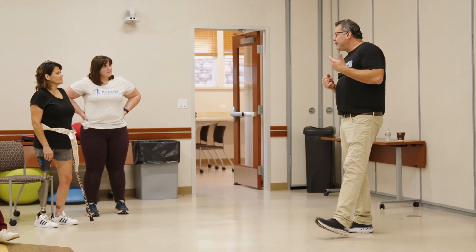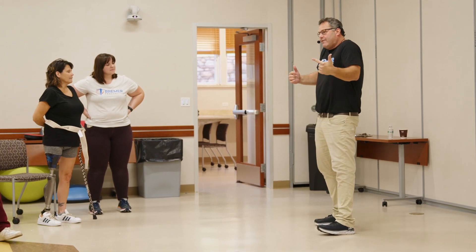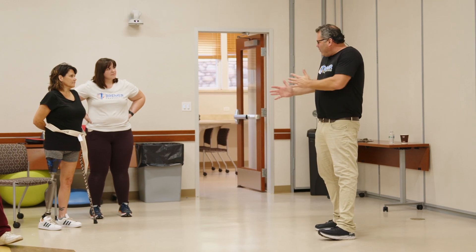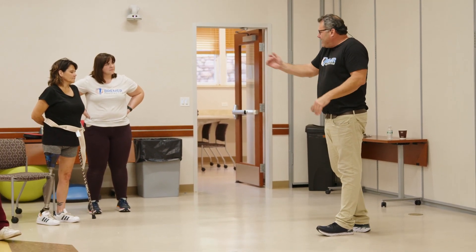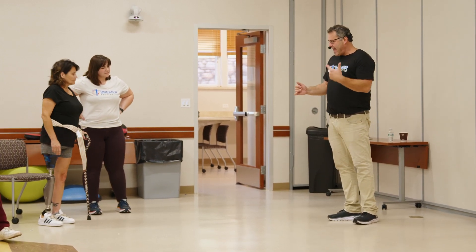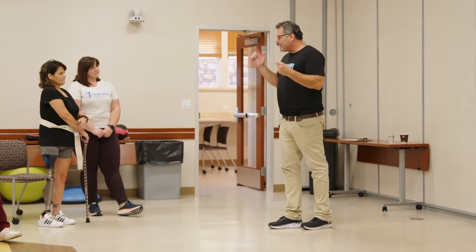He'd say, 'You need to transfer your weight, you need to pull here.' What people don't understand is that in your mind you feel like you're doing that. If you're telling me I'm not transferring enough weight to the prosthetic side, we try to change the language: 'This might feel exaggerated, but this is where you need to be.' The first time, when I started working in prosthetics, I was walking down the hall at the VA and all of a sudden I started engaging that muscle and it changed how I walked immediately.